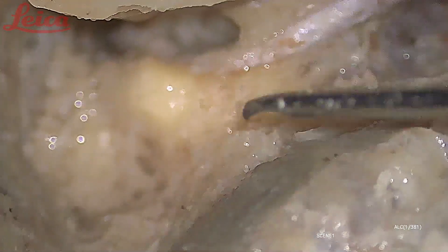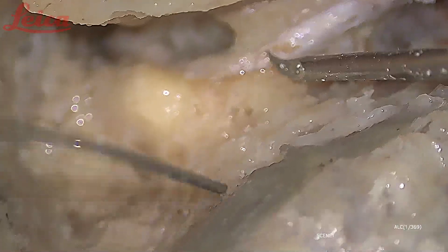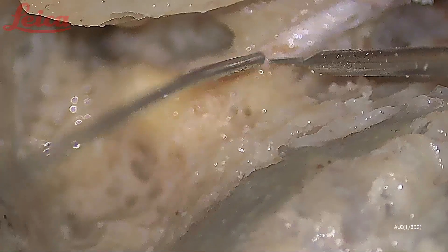For this I use what is called a tenotome. This is the instrument called the tenotome — it is very blunt, but it has a beveled edge anteriorly which will help to incise the facial nerve sheath.